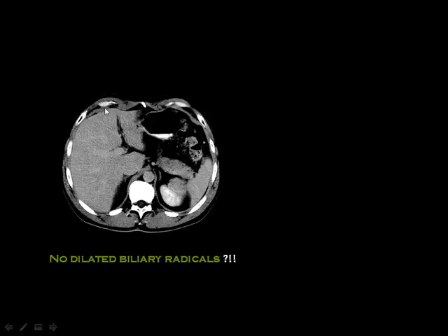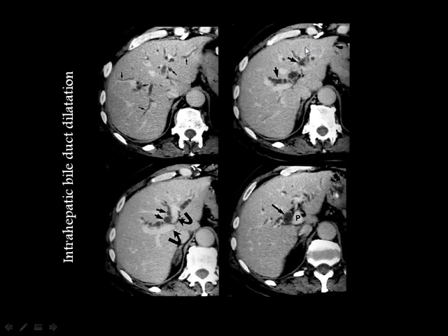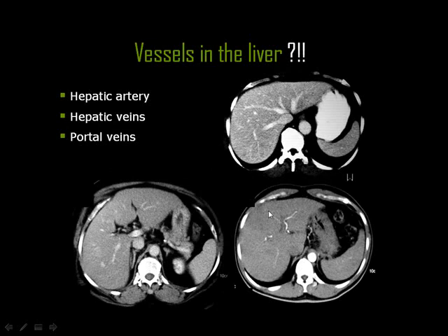And if you look at the liver, you should not see any black lines inside the liver. If you see black lines inside the liver, you know that these are dilated biliary radicals. And dilated biliary radicals, this is an example. You see, these are dilated biliary radicals because the normal bile ducts are not usually seen by CT. But if you see dense tracts or dense lines passing through the liver, these are vessels.